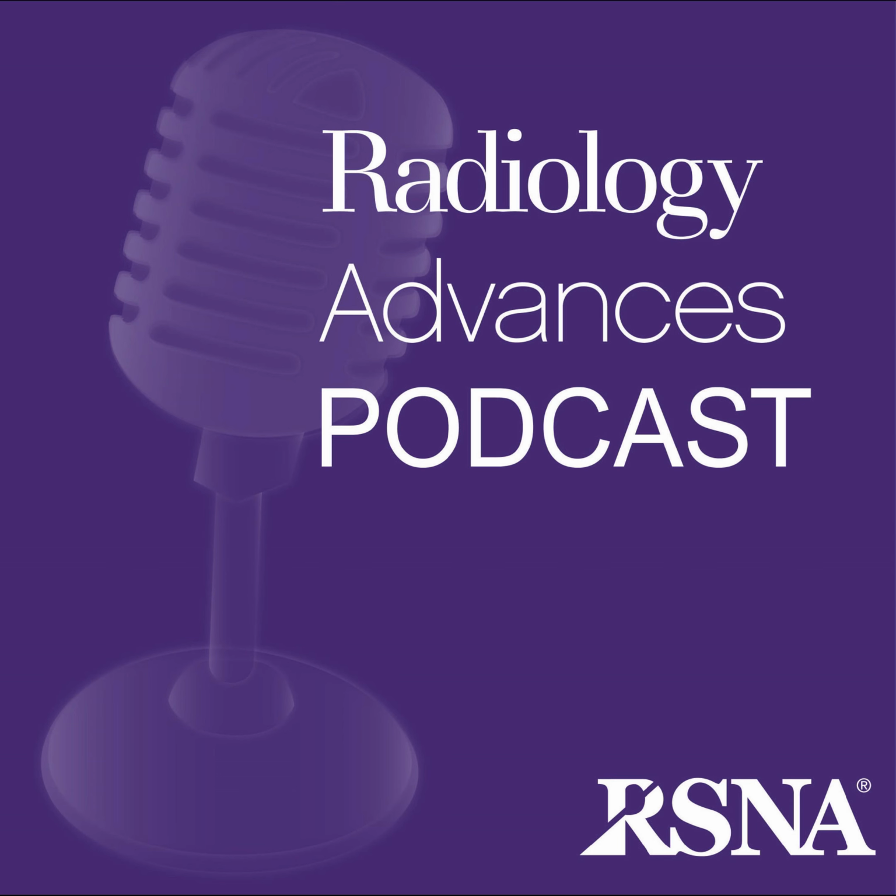Is that a good trade? I think so. The key is that the smoothing didn't actually hurt the final volume measurement. That MAVD of 6.7% proves it. The critical finding that APD volumes are larger than PD volumes was preserved. So we've moved from validating images just on how they look to validating them on whether they give us the right data. Precisely. The pipeline works and was tested on an external cohort which provides support for its clinical utility.